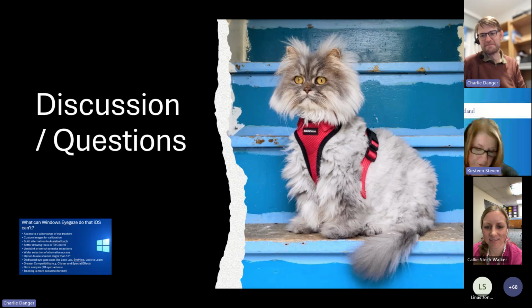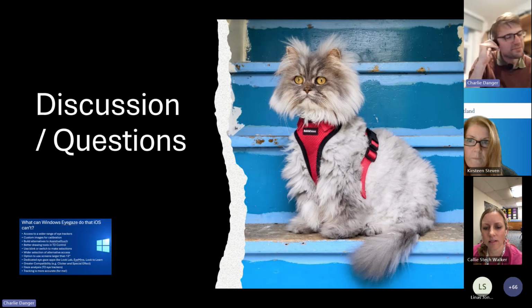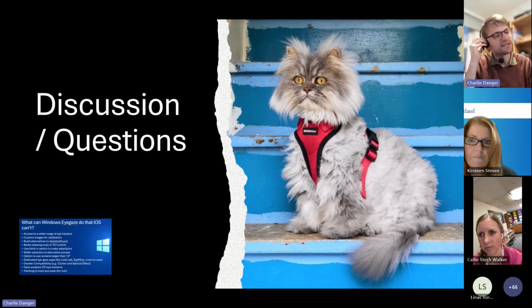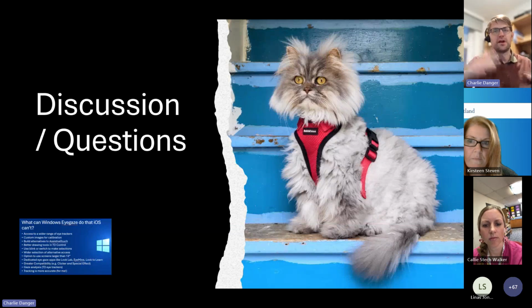Who knows? Interesting. Somebody said, is it a better experience if you speed up the gaze duration to maybe 0.5 seconds or so? Somebody else has asked that too. I would say no, not really. The problem was fixating, but the problem was also accuracy. There would be so many hits if it was set to 0.5. I can see it darting around, and to think that it would actually click on all of those things would probably be driving me crazy. But obviously it's down to each individual. Individuals might find it's better.